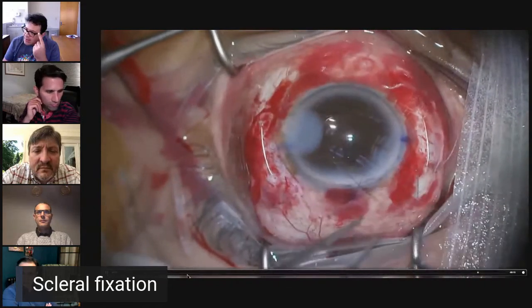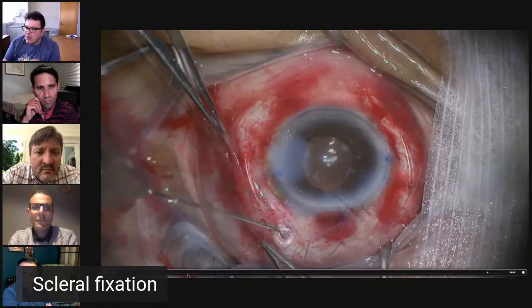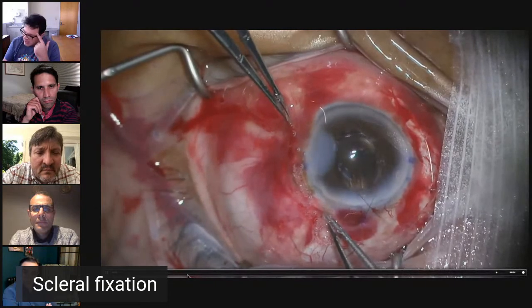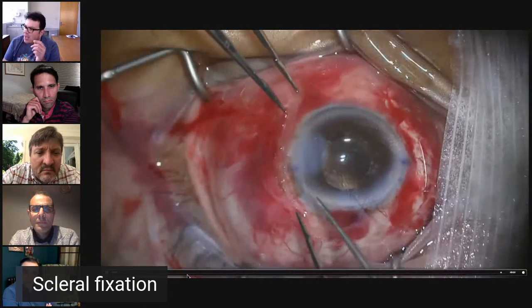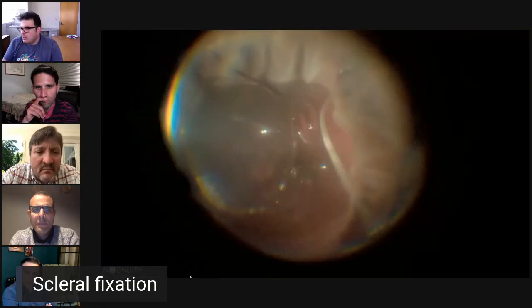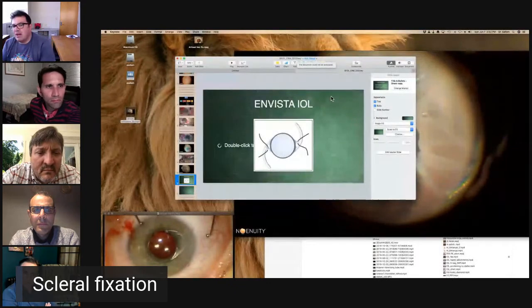And then after that, I modified my conjunctival opening, but I actually glue it. Now I've modified my conjunctival opening, having seen videos of Chris. But glue works well. And if the glue is not holding, I put a couple of sutures. I try to avoid multiple sutures. Damage of this. And I find that really works very well.